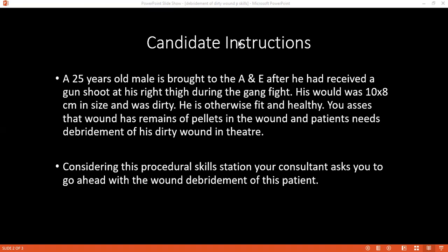So these are the problems. And I cannot do the redo surgery properly if I close the wound. Would you prefer trimming the skin? Trimming of necrotic skin can be done.